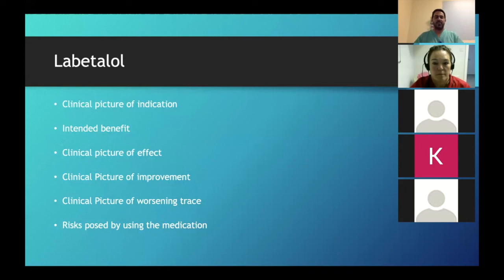Now, going back to the picture effects. The baby with hypoxia, the baby we started off with, or the baby before the hypoxia, starts off with a low baseline. Variability is already reduced. We saw some decelerations. And then what? How do I figure out that this baby is well? Because this baby is not going to be raising its baseline that well. The baby is not going to be showing the deep, wide decelerations that we expect anymore, because these are triggered by the redistribution.